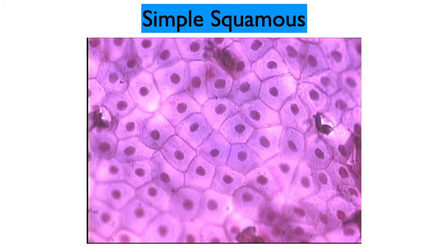So oxygen-rich air in the sacs needs to get into the blood, so the oxygen needs to diffuse through there very readily. And going in the opposite direction, the CO2 that has built up in the blood as cells have metabolized and produced CO2 as a byproduct, we need to get that into the air sac so we can exhale that. So very flattened types of cells and very characteristic for where you want easy diffusion.